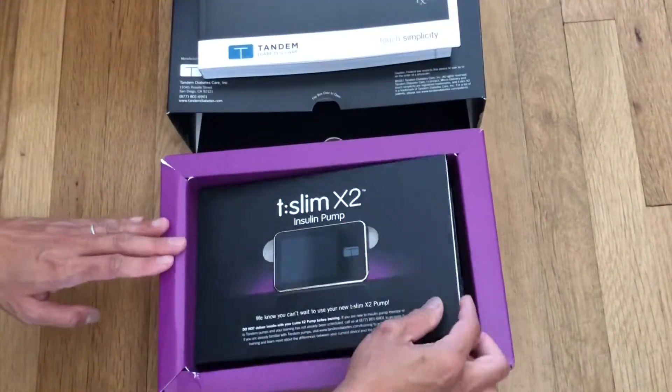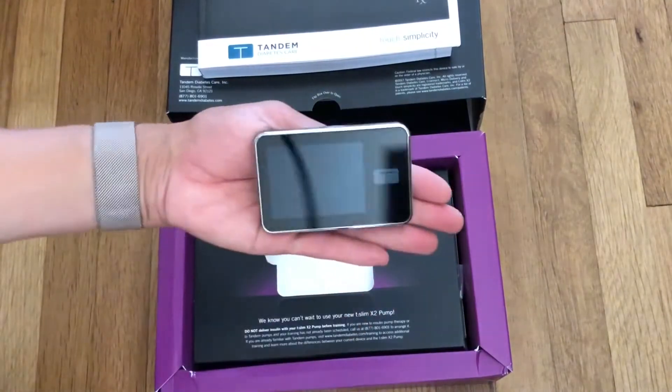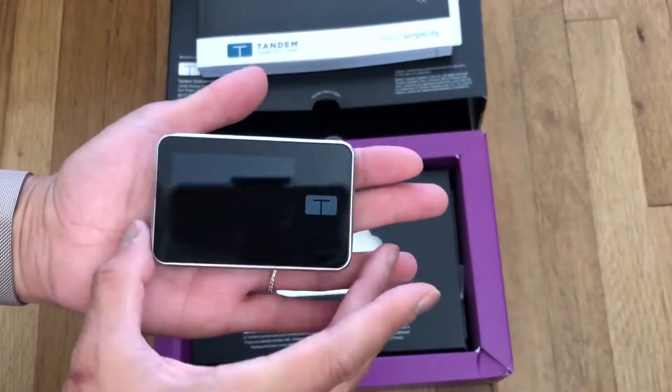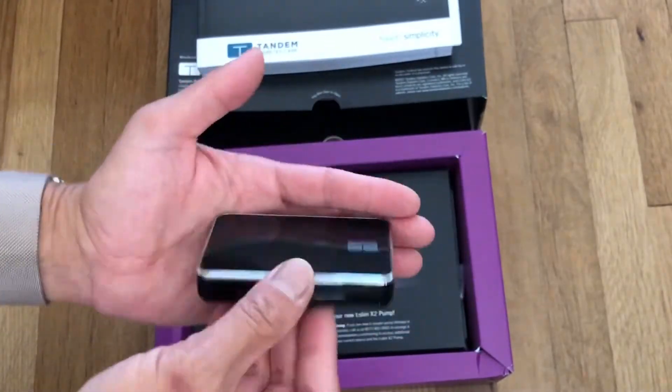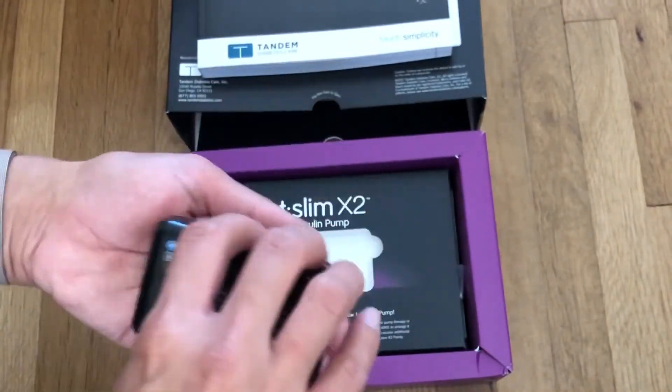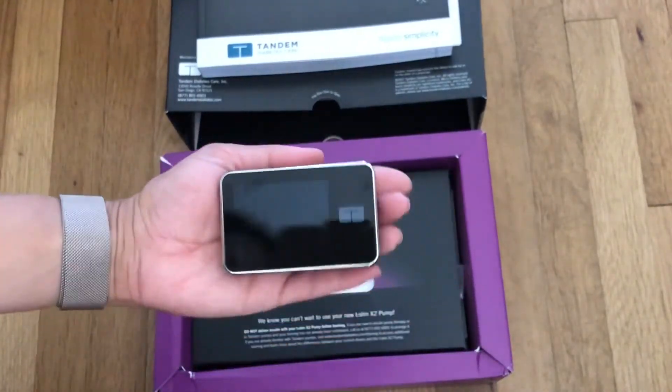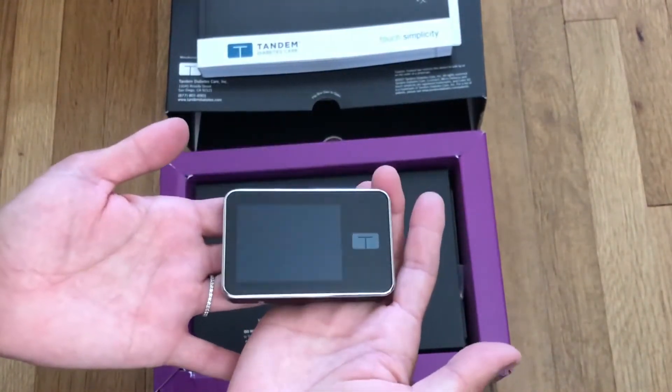The actual pump is beautiful — it's very sleek and tiny, but it is pretty heavy. I don't think my daughter would enjoy wearing this; it does have some weight to it. The back is where the insulin cartridge goes, so you slide that off and slide the cartridge in.